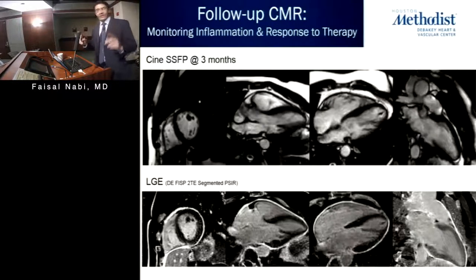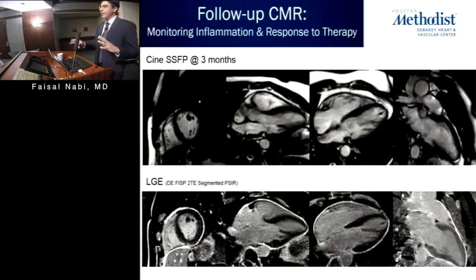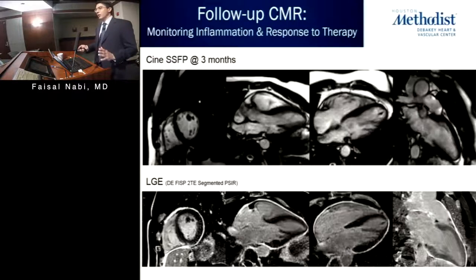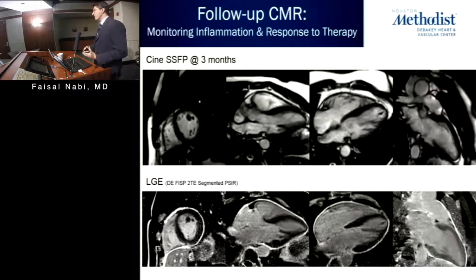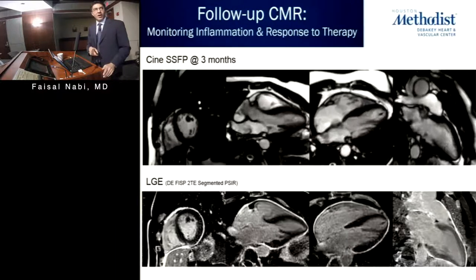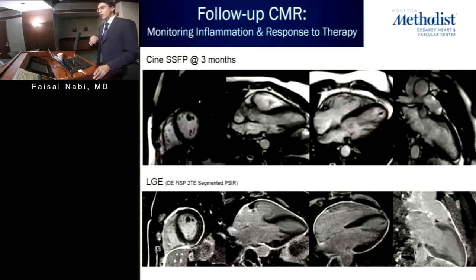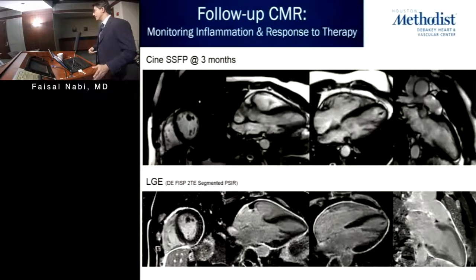Sure. A lot of your points are well taken. My next case will show us how CMR can show edema and inflammation. A further slide I have is where they've actually taken constrictive pericarditis patients and done biopsy on these patients who are operated. This uptake of gadolinium is pretty much pathognomonic for inflammation by histology, demonstrating an infiltration of fibroblasts, neovascularization, and inflammatory infiltrates. Yes, sir.